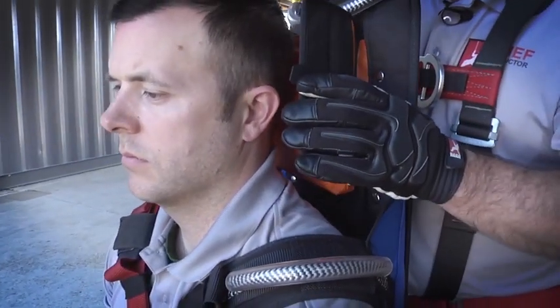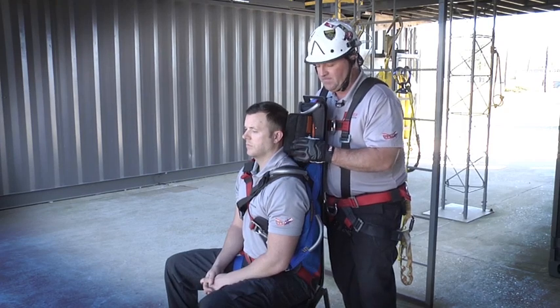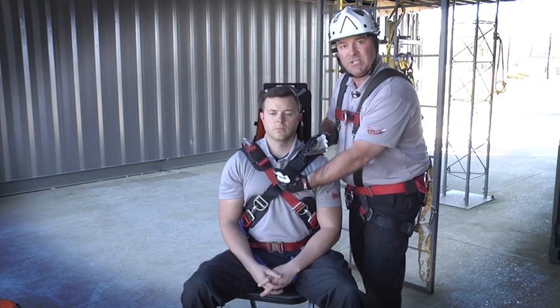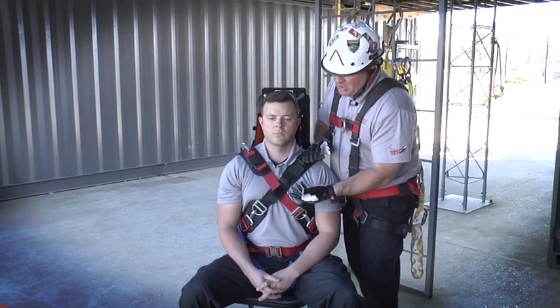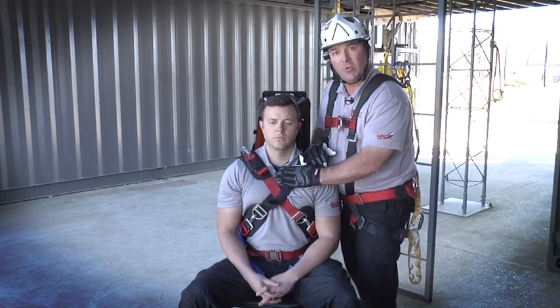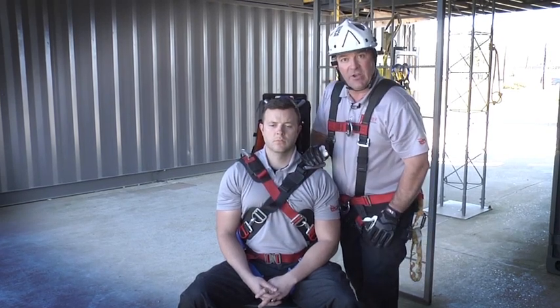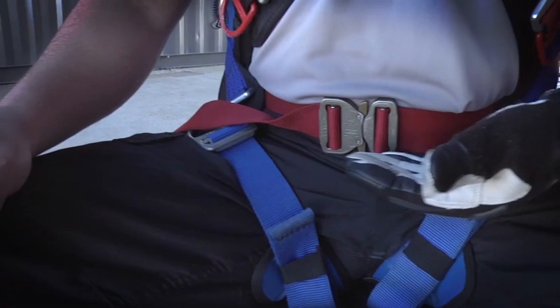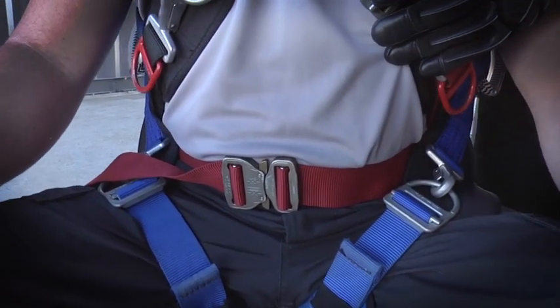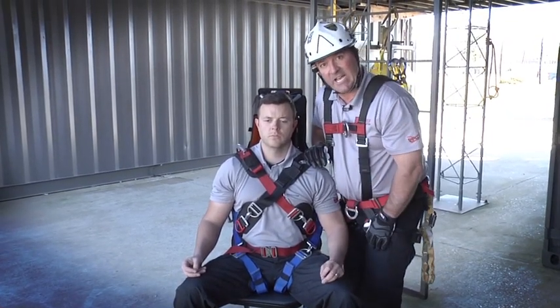Up here it has an adjustable sliding head bed, which is great and accommodates patients of different sizes. On the front of the device we have chest straps that cross over each other. If you have a large patient, we want this X to be somewhere down on the sternum. If it's coming up on their throat, you are allowed to go straight down over the shoulders in an H-style configuration. Down at the bottom we have a red waist strap, two blue leg straps that connect back, and in the middle there's a D-ring attachment point for a tagline.